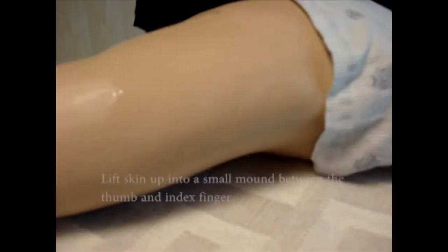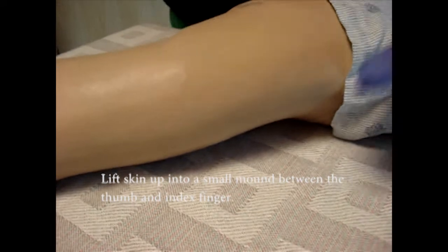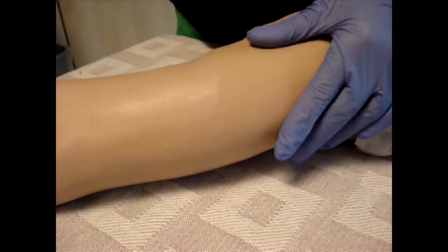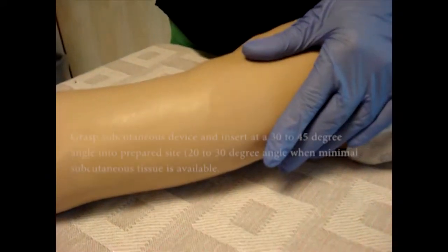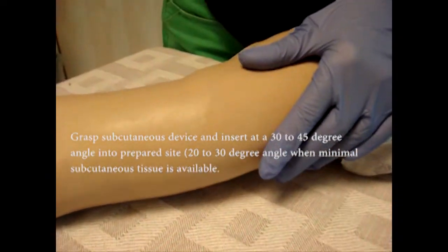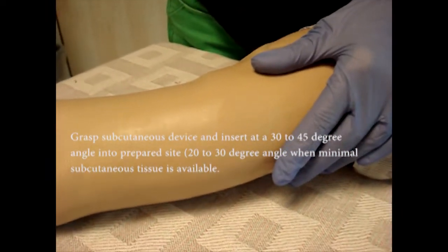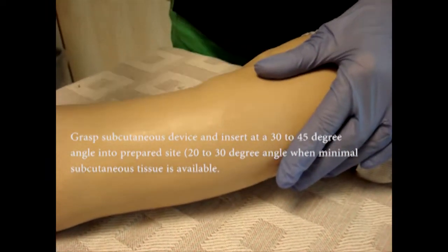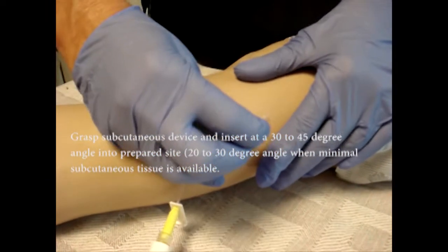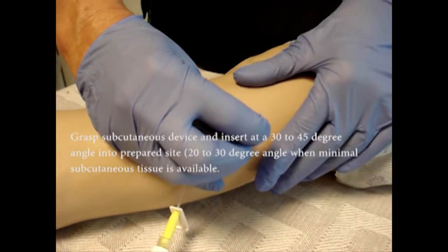Lift skin up into a small mound between your thumb and index finger. Grab the subcutaneous device and insert at a 30 to 45 degree angle into the prepared site.